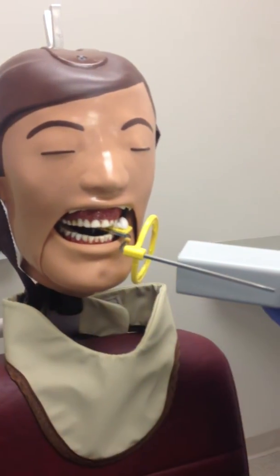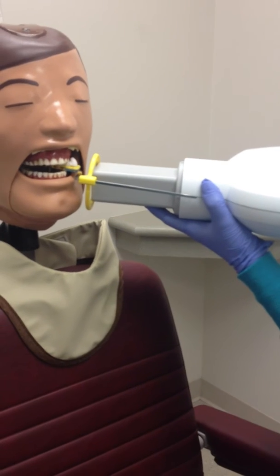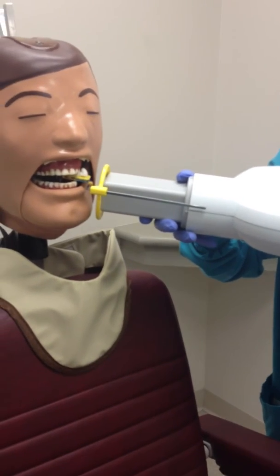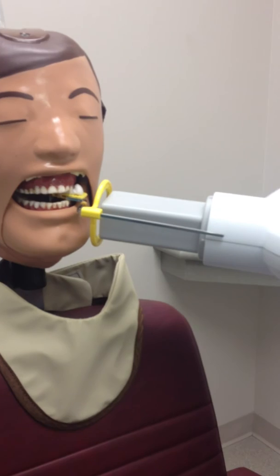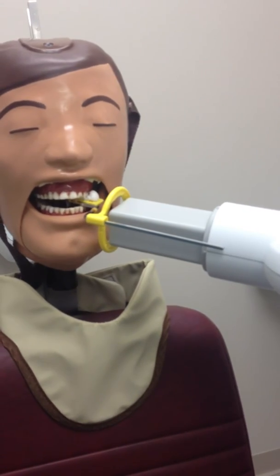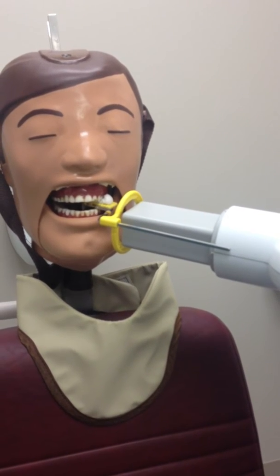Place the PID on the ring on the horizontal outline. When making this radiograph, the following angles are averages used to help position the XCP: a horizontal angle parallel with the contact between the premolars, and a vertical angle of positive 5 to negative 5 degrees. There are no contacts that must be open for this radiograph, as its primary purpose is to show the tooth and surrounding bone.